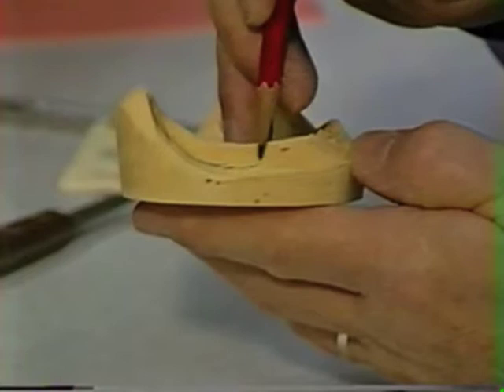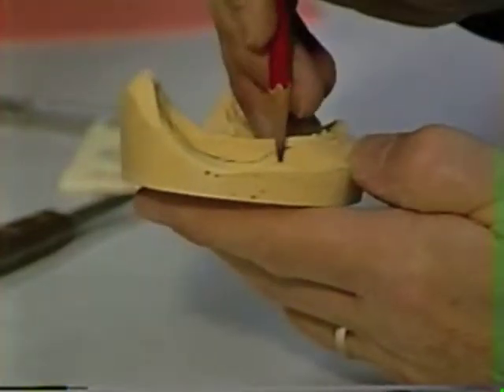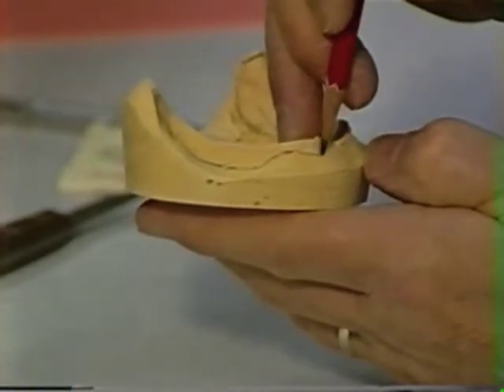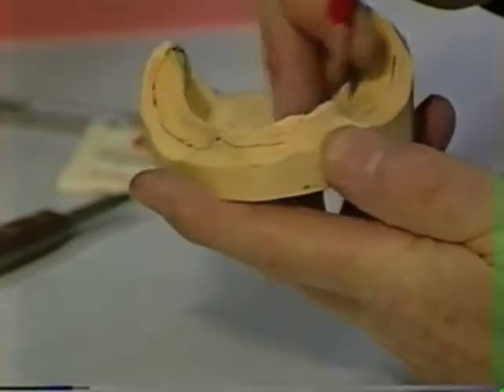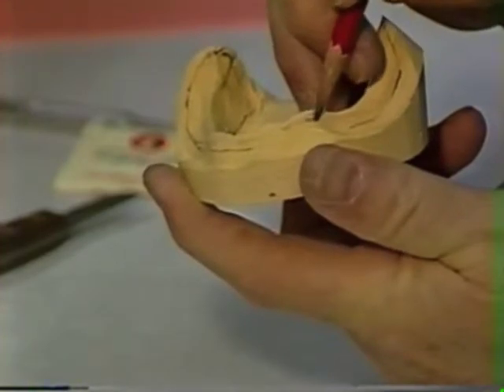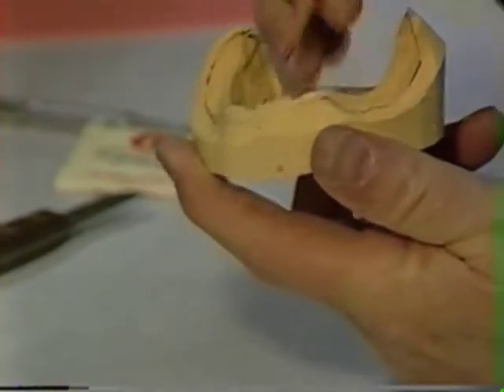Then the tray is just going to gently sweep up into a notch for the buccal frenum that we find right here. Then it's going to come back down just enough to go to the depth of the fold of the mucolabial fold. Right here's a better indication now of a buccal frenum coming up. And here's how far we want that tray to come up to allow for a notch for the buccal frenum.